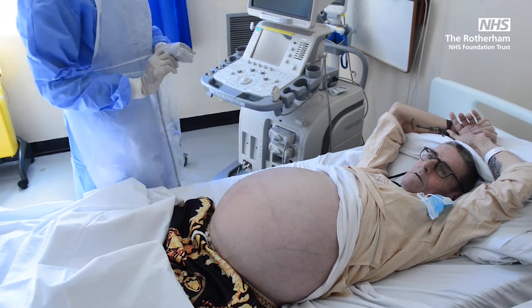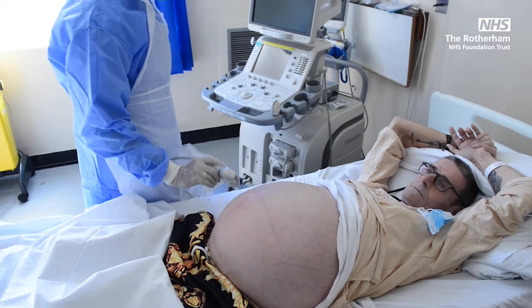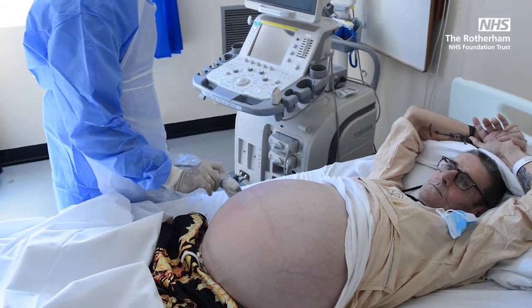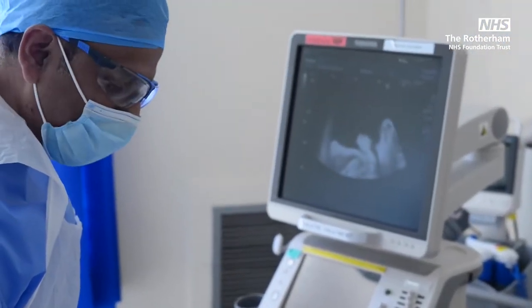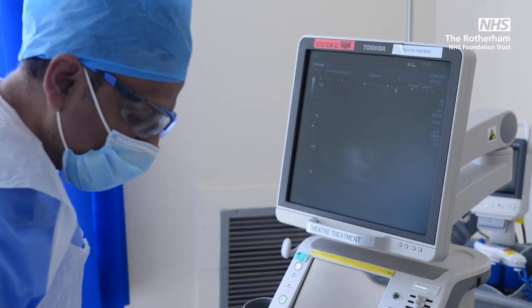Okay, so Patrick, it is going to be a bit cold. Yeah, so he's got plenty of fluids. I'm going to go for the lower space.